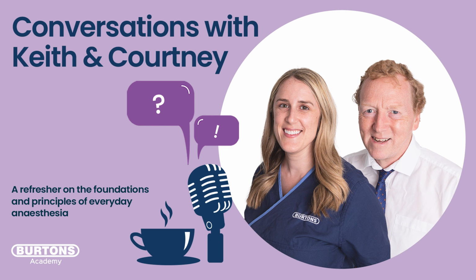We're going to push air into the lungs. So now the diaphragm is going to stay domed and at rest because it's not part of this process. So we're forcing that diaphragm to flatten, we're forcing the rib cage to expand. And to do that, we need to put in volume. It's not really the volume that does the work, it's the pressure that results. And that's the one that we need to consider. So we need a certain amount of pressure, has to be positive pressure, to inflate that chest.